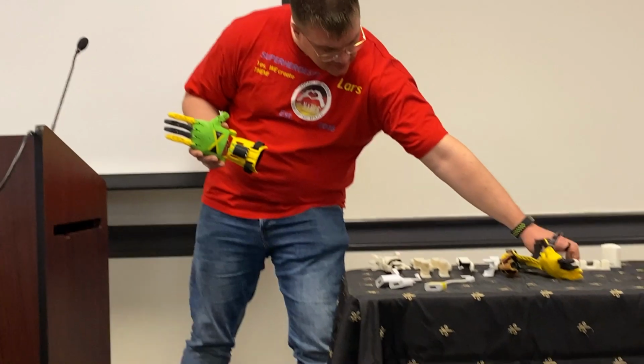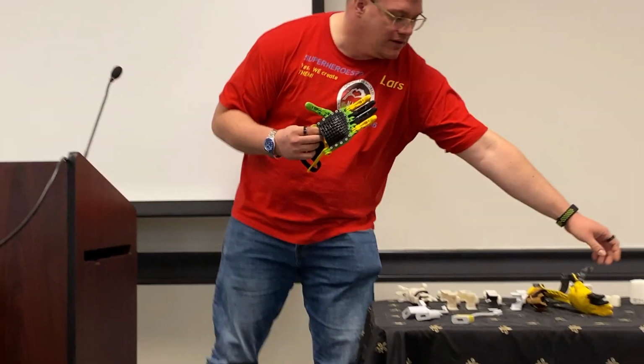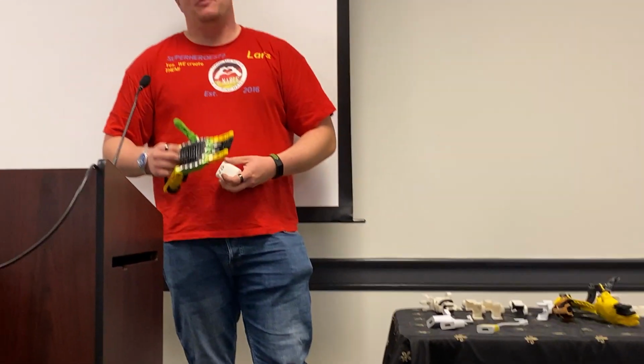So I came up with forming tools. For example, for forming the gauntlet, I just need 2 tools. And for forming the mesh plate, I have another tool to just push it in there. And to make it accurate, I have a plastic bag. I label it with a precision size, and then I can just put it away, and next time I have another kit, the same size, it works fine.